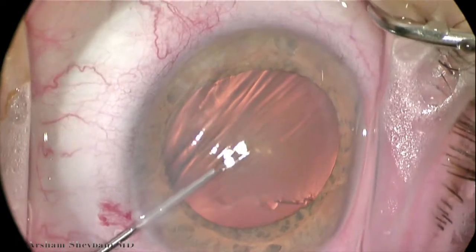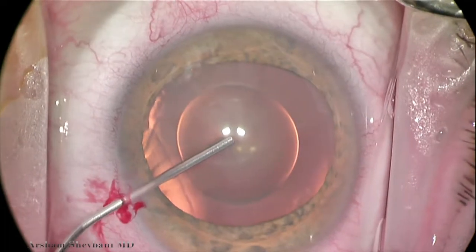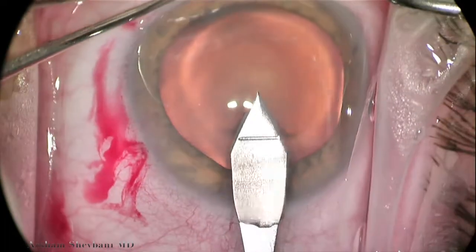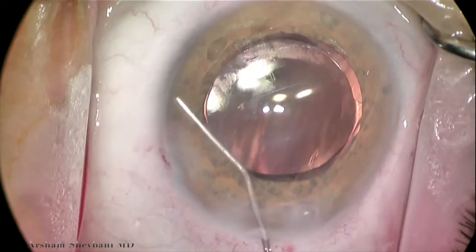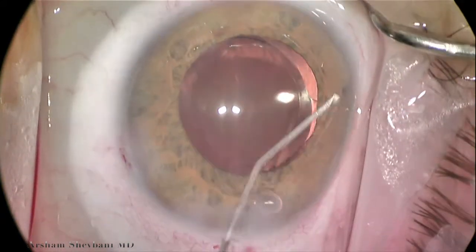Hi, I'm Arsham Shabani, anterior segment and glaucoma surgeon at Washington University in St. Louis. This is a case of primary angle closure glaucoma with over 300 degrees of peripheral anterior synechiae. We'll be demonstrating the Katina disposable single mirror, which is nicely designed with a curved undersurface through which you can pass instruments.